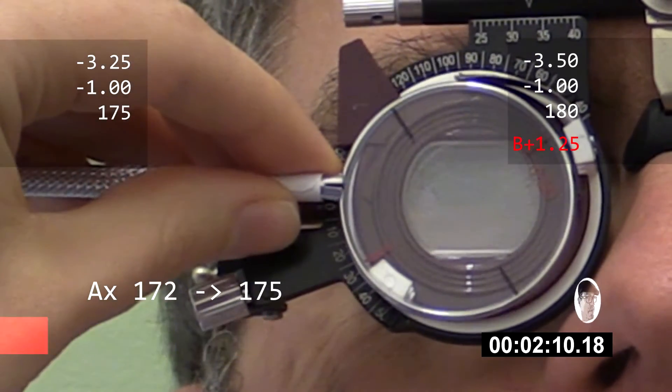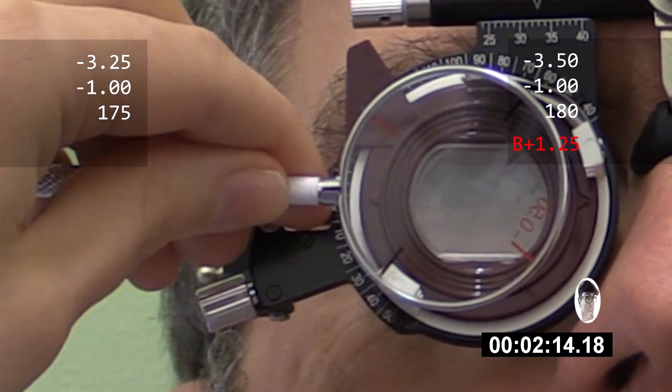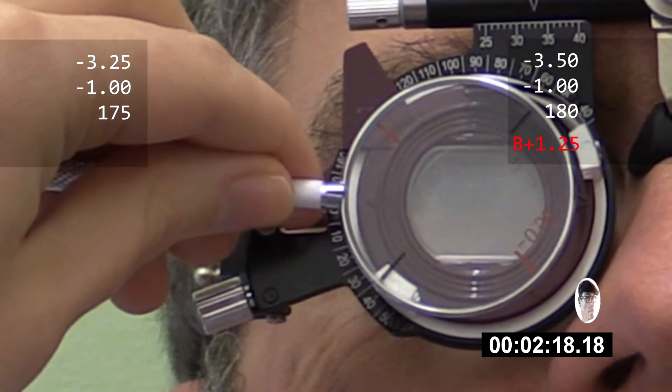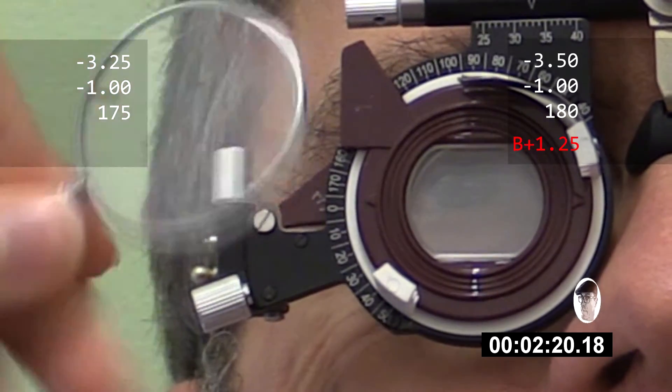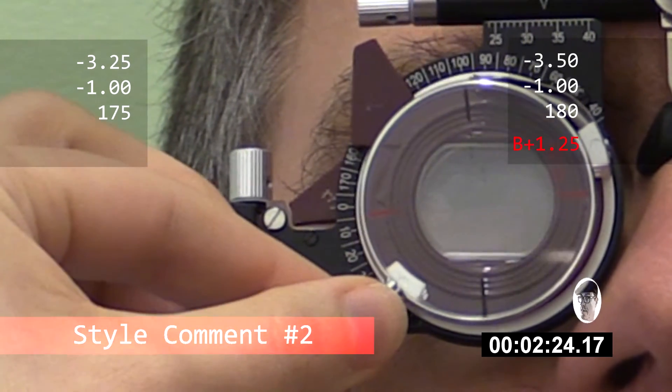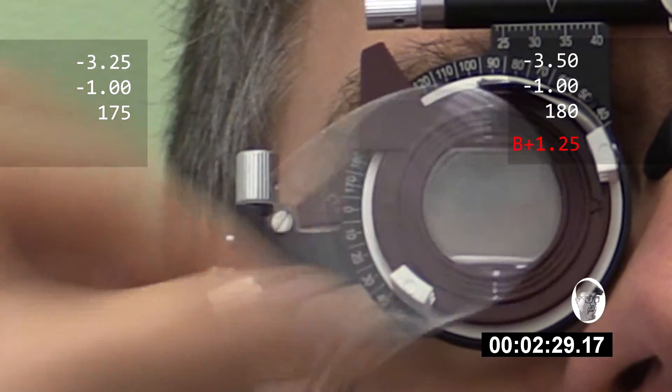One or two? Two. Two. Okay, and one or two or about the same? That's one, and that's two. Probably about the same, I reckon. What about with three or four? So that's three, and that's four. Four. Four.